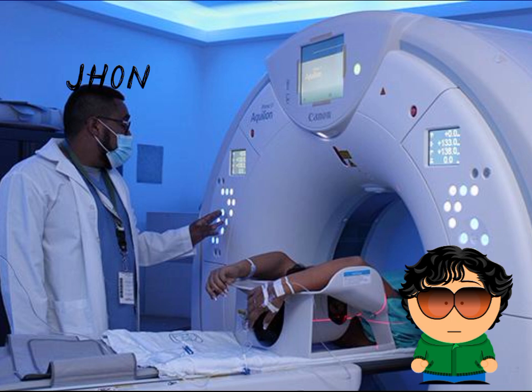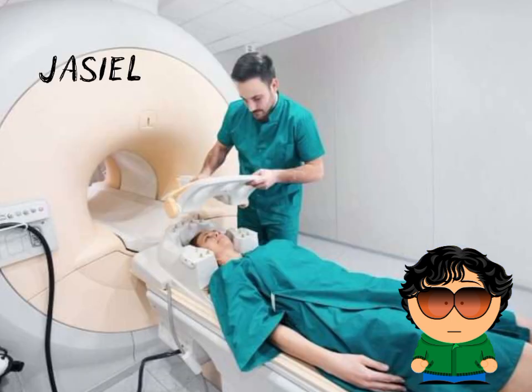Advantages: precise visualization of internal organs and structures, early detection of disease, guidance for medical and surgical procedures. Application: diagnosis of tumors, infection, trauma, cardiovascular, and neurologic diseases.